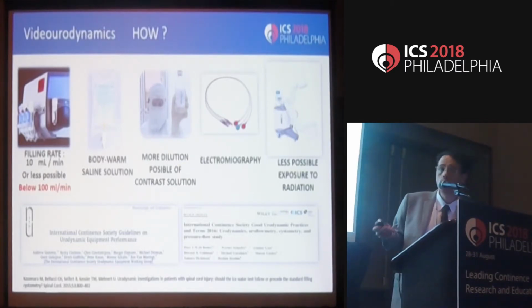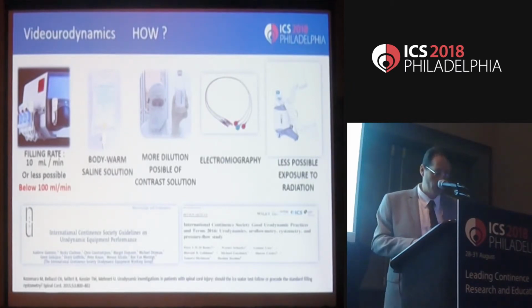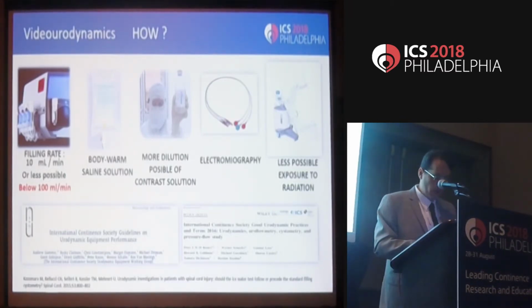electromyography, we have to establish that I use surface electromyography, but I do not always get the results that I want. I prefer to use needles, but in my country it's not so easy to perform electromyography with needles. We have to go with electrophysiology, and sometimes it's not possible. And with the time of X-ray, we have to give the patient the least possible exposure to radiation.